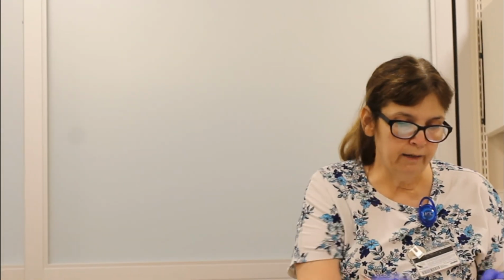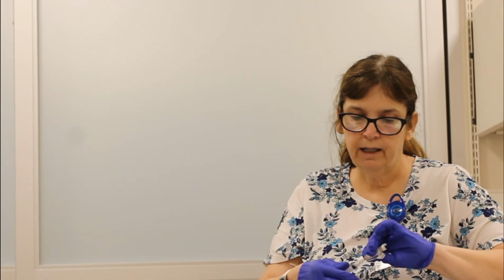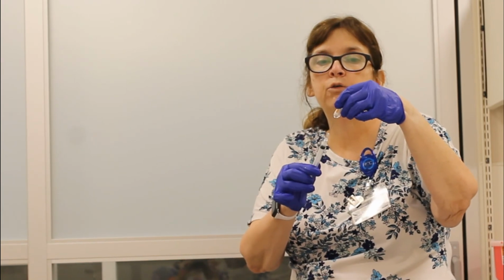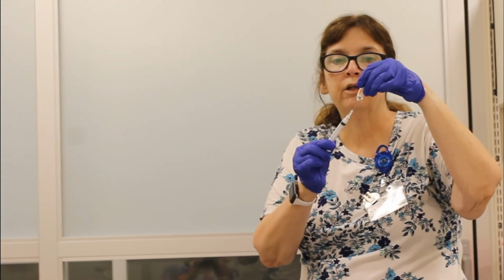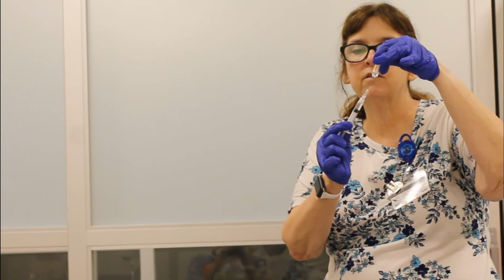This is the time that you need to have a filter needle. So I have a filter needle here, because I want to filter out any glass sharps. Now I'm going to say that I need 1 mL from this ampule. This is the thing that students have the most trouble with. You can turn it upside down, and you want to turn it upside down because of how you use ampules in the field. And so you want to draw out your 1 mL. Let me release my pressure with my syringe. Draw out your 1 mL. Do not inject air into it. That's the thing that will break the seal.